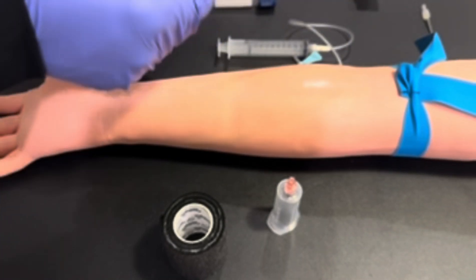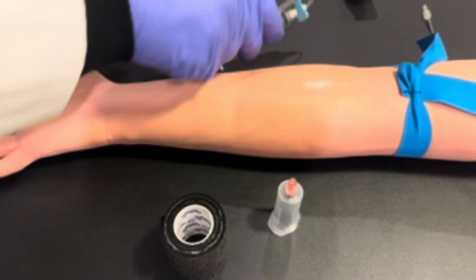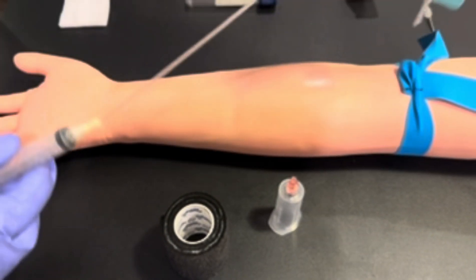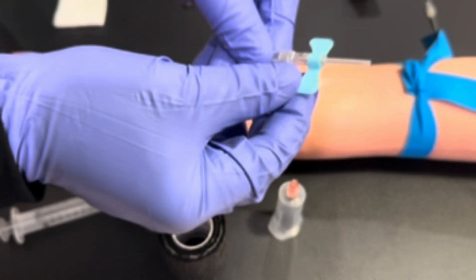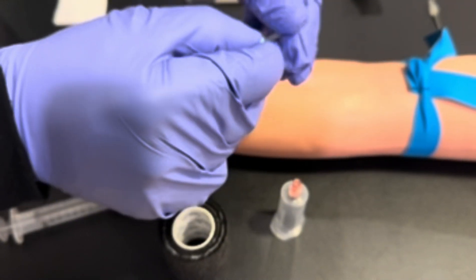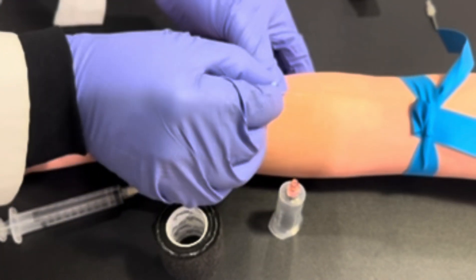Once you have prepped and cleaned the venipuncture site, allow the site to dry. Pick up your butterfly needle and anchor the vein.